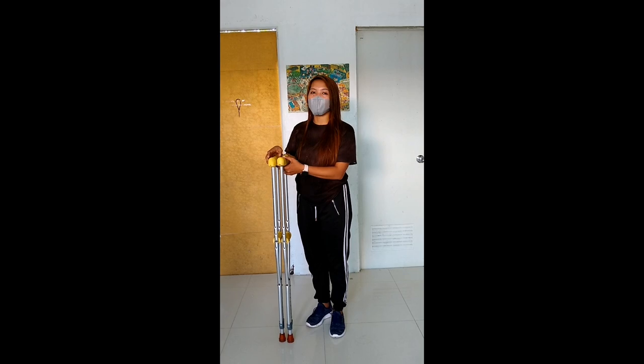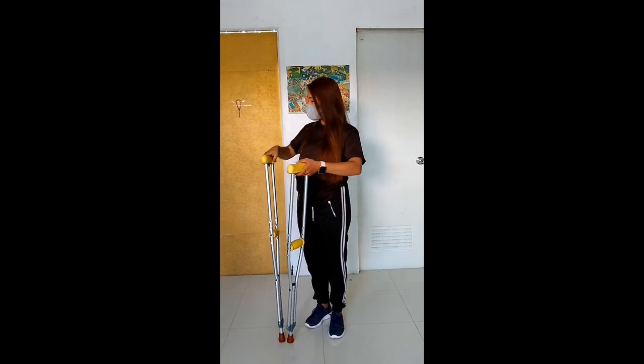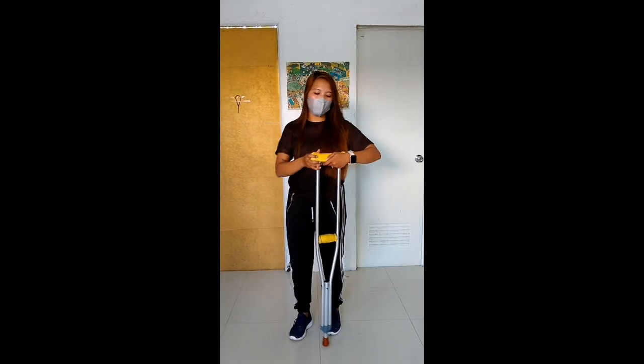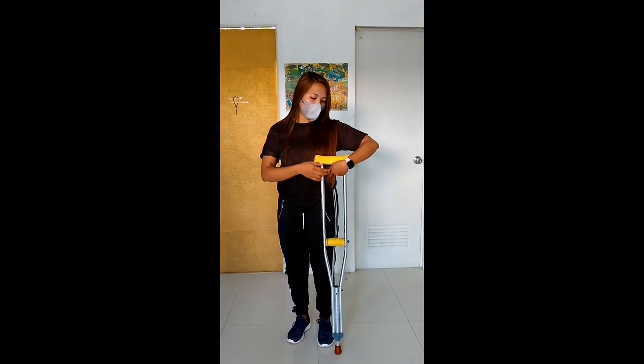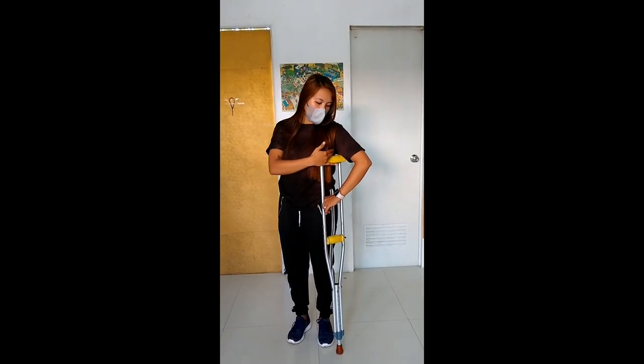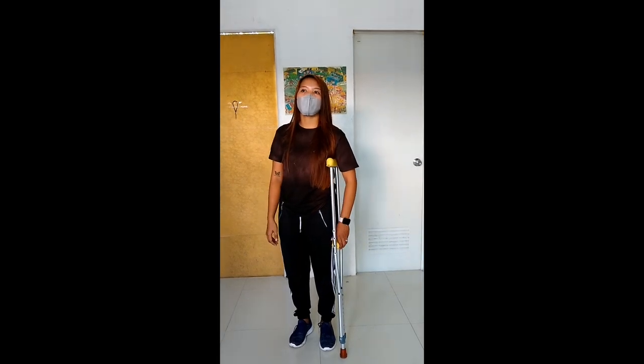Una po nating gagawin ay dapat po ay alam ninyo ang tamang sukat ng itong crutches. Dapat po ay may pagitan ng dalawa o tatlong daliri sa inyong crutches. Ito po para maiwasan ang nerve damage.